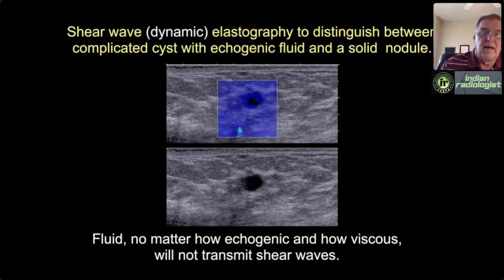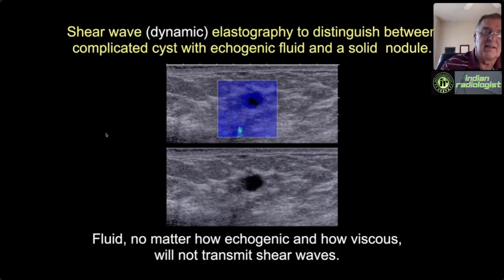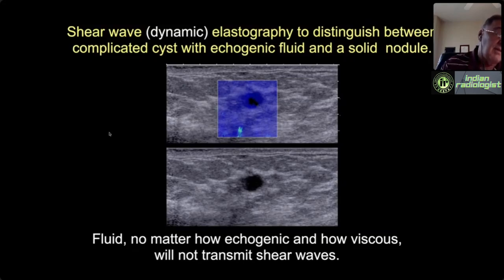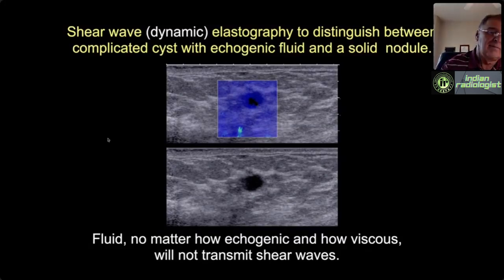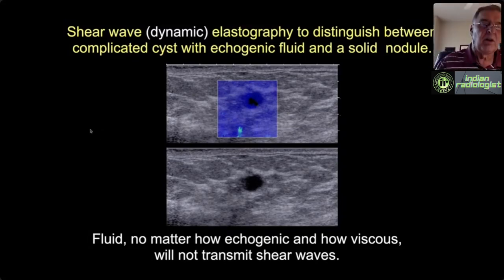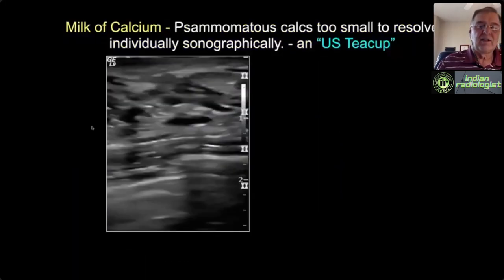Shear wave elastography also helps: shear waves won't transmit through fluid no matter how viscous, so black in the center indicates a complicated cyst not a solid mass. A caveat: liquefactive or hemorrhagic necrosis in a grade 3 triple-negative cancer can also give black in the center. Another caveat: shear wave and strain elastography don't work well with cysts smaller than one centimeter, which is often precisely where our dilemma lies.